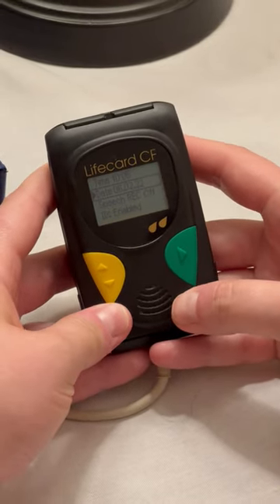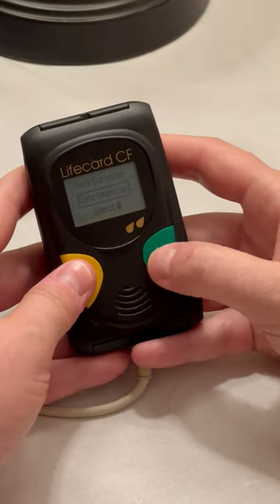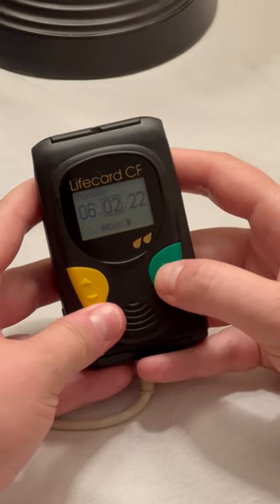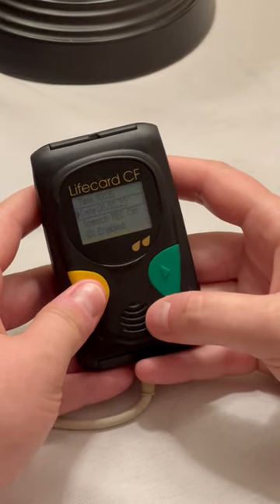You can repeat the same process for the date. Scroll to date, green button. We're doing American style date, which is month, then day, then year — same exact process. Adjust the number until you get to the correct date, scrolling through. That is set.